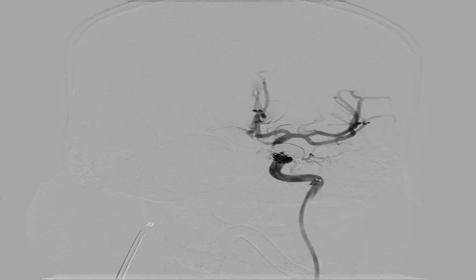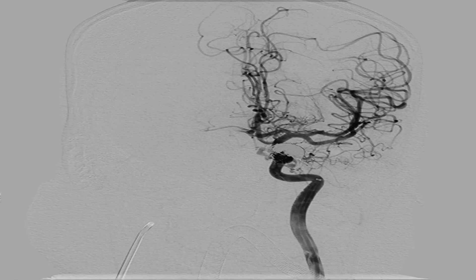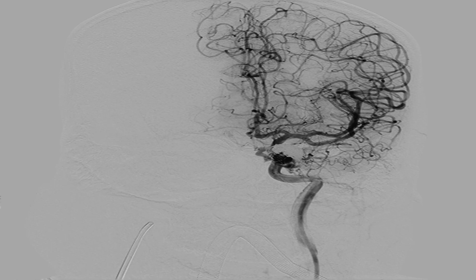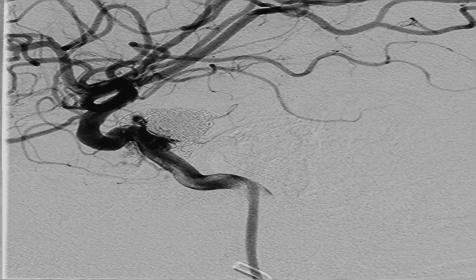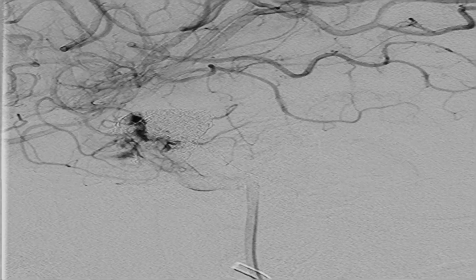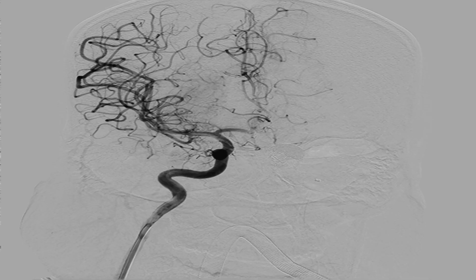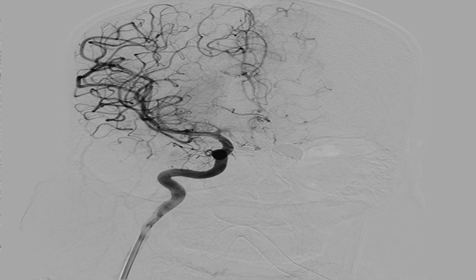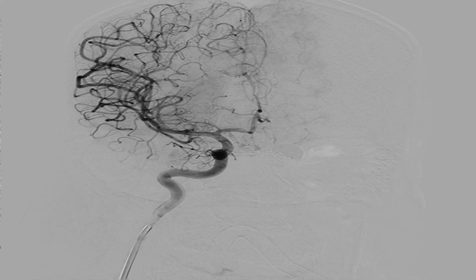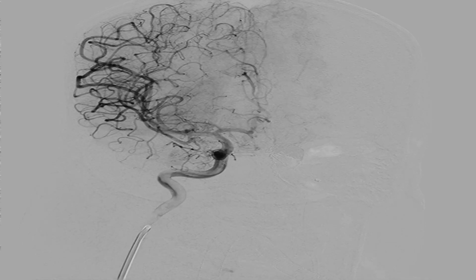Fluoroscopy from the left ICA after coil and liquid embolizing system placement showed complete obliteration of the fistula along with a patent parent left ICA. Fluoroscopy from the right ICA was taken and no cross-filling was seen, thus completing the entire procedure with the desired end result.